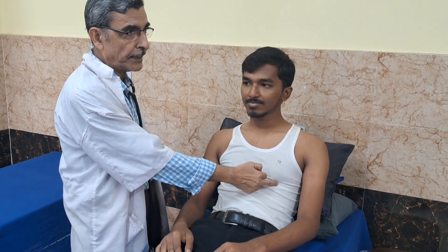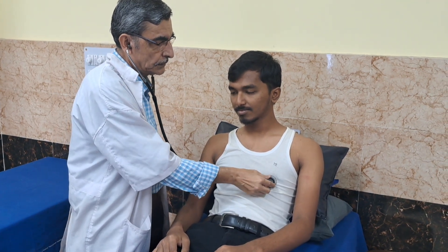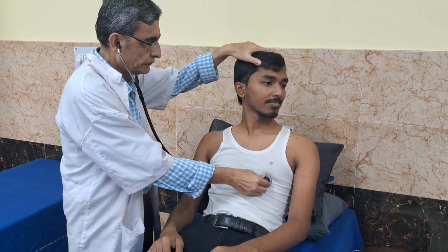The mitral area may shift, while other areas are fixed. Hold the stethoscope correctly, with the earpiece directed medially and forward, then auscultate starting from the mitral area. Mainly the diaphragm of the chest piece is used.